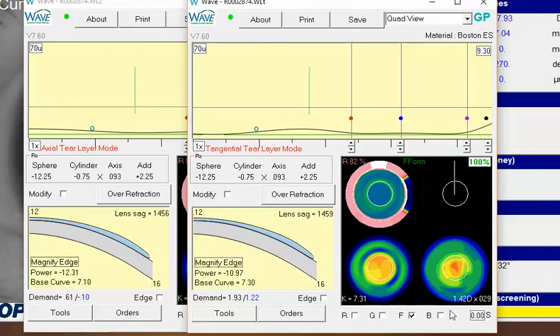I would probably go to freeform, although you have a very symmetrical looking cornea here. I would still like to go freeform. That gives you a chance to capture a little more unique topographical nuances here in the peripheral part of the cornea. Go to freeform. I would leave out the aspheric design, leave it freeform, and then redesign in that manner. And now I get a lens that tends to look like it lines quite nicely through here.